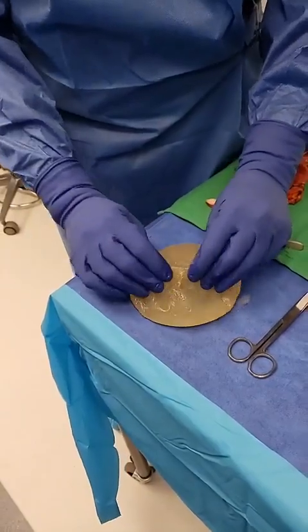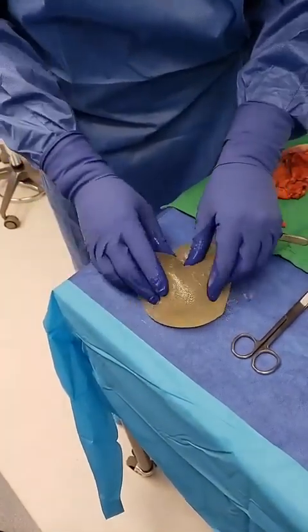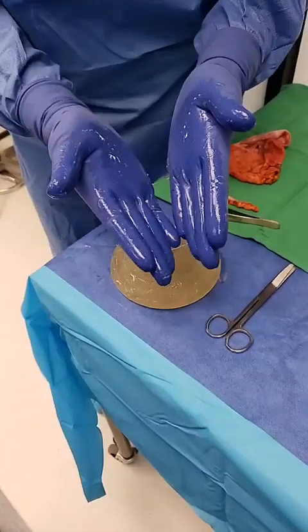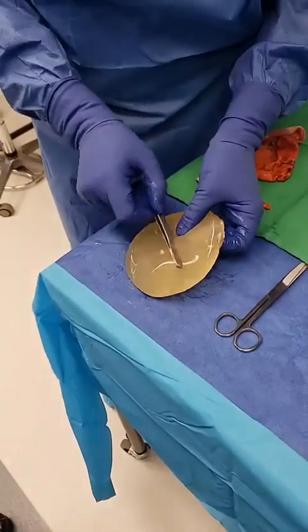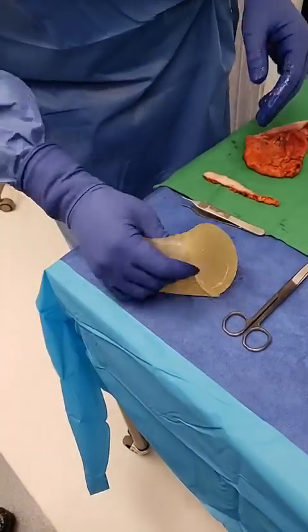And there's a lot of weeping over here. Look at all that tissue around. It's just giving off all this toxicity, if you will. I invite my scientists who are listening to do research on this fluid, because this will tell you what is slowly leaching out. And this is that fluid, despite what is an intact implant.